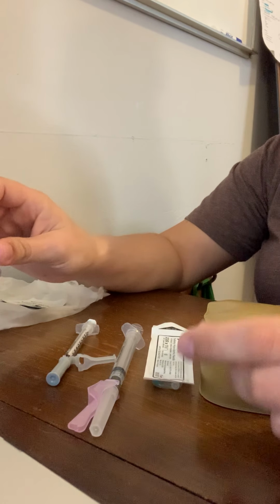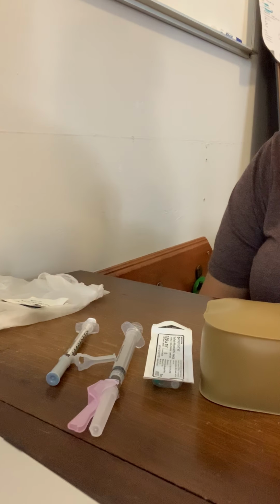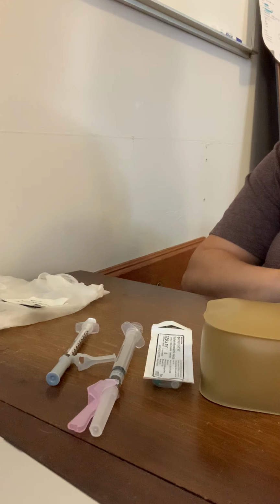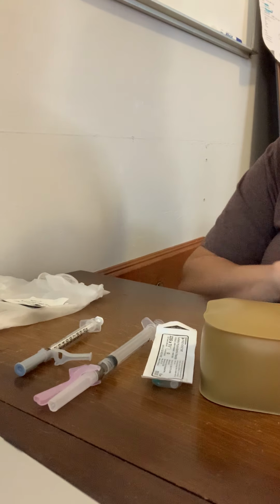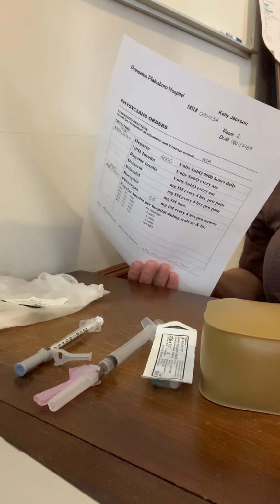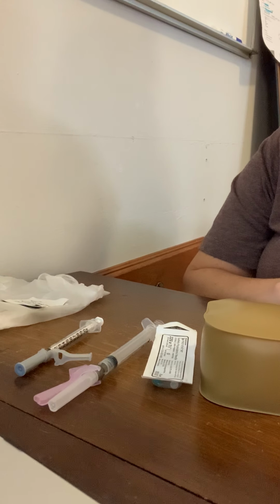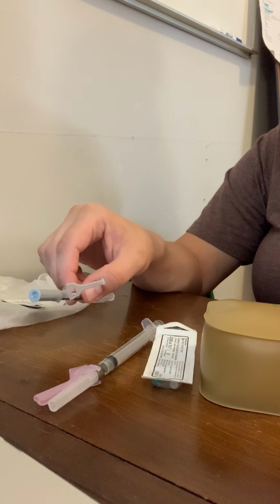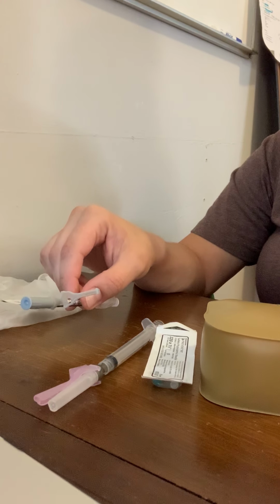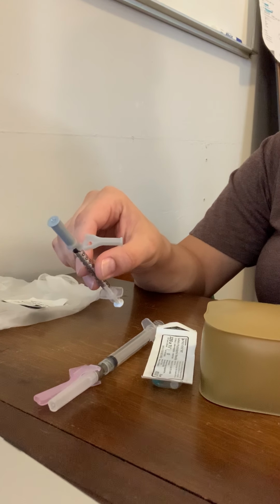is 4/2021. So now I'm going to drop my medications and do my second check of the MAR with my syringes and my needles, my vials, and the doctor's orders. The order was for 4,000 units of heparin, and the available is 5,000 units per 1 ml. So I will be giving 0.8 ml of heparin.